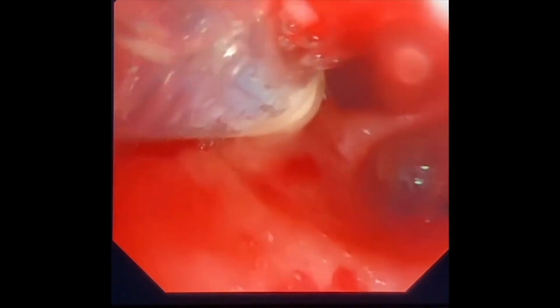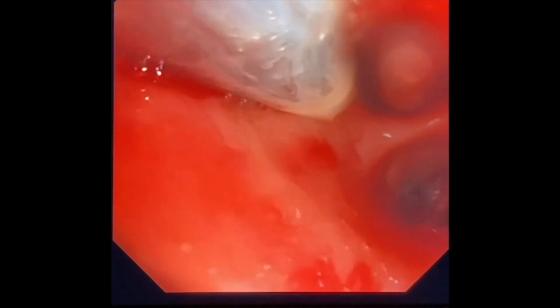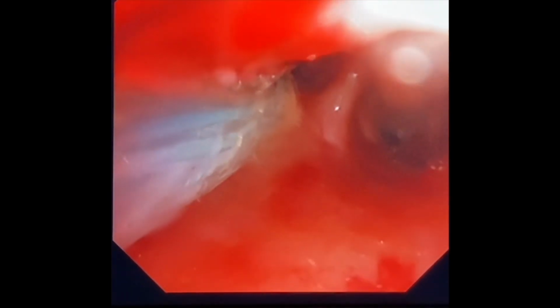The bronchoscopist is performing bronchial aspiration. You can see there is considerable pus trapped in the airways, and this is as a result of an obstructive pneumonia from the esophageal cancer causing complete airway collapse.